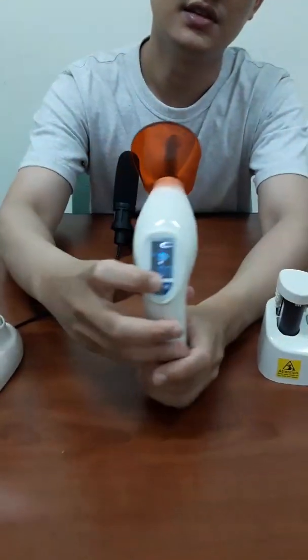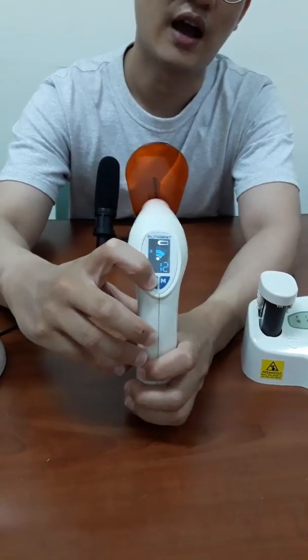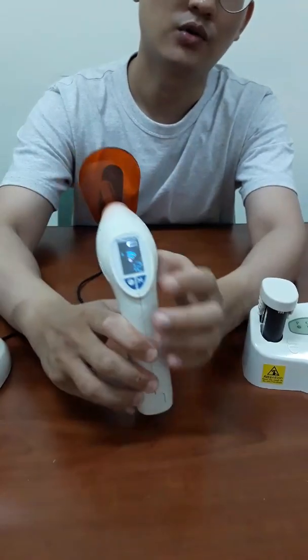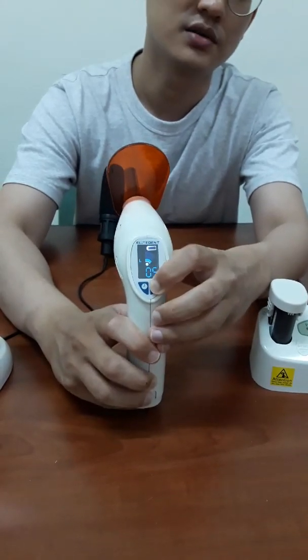The function is also very easy to understand. We have four modes: high and low intensity, and the circle, and the round up. And also, we have a time setting, so you can select what you want.